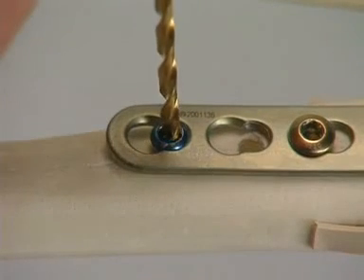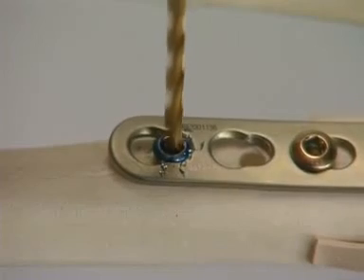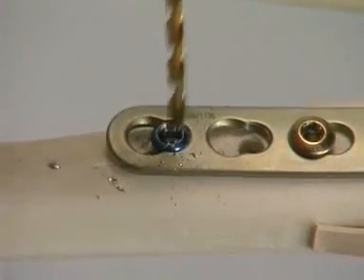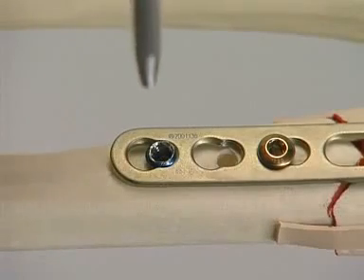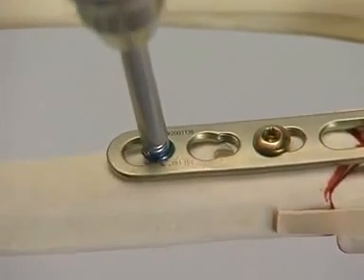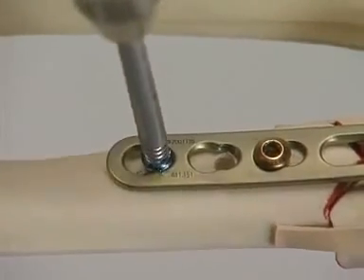In the case of screws that are difficult to remove, the hexagonal socket is deepened with the 2.5 mm drill bit for metal until the conical extraction screw is finally wedged in firmly and the locking head screw can be removed. In this way, it should be possible to extract all the screws from the plate.